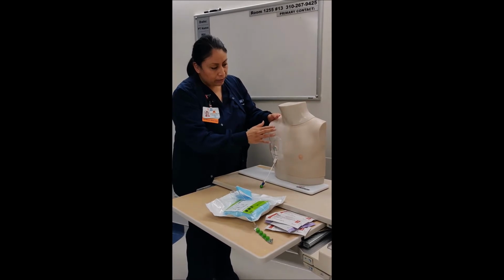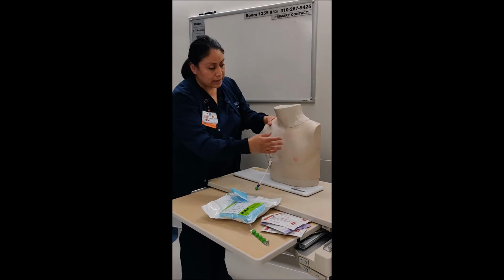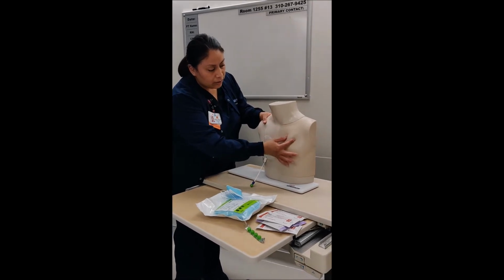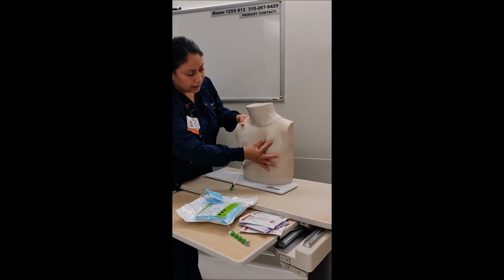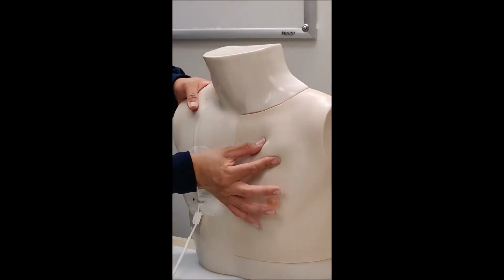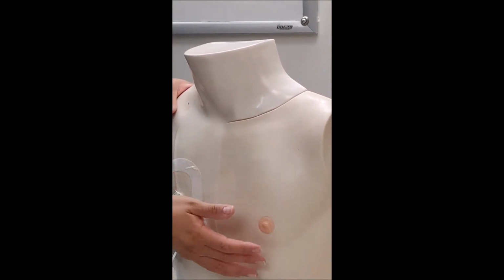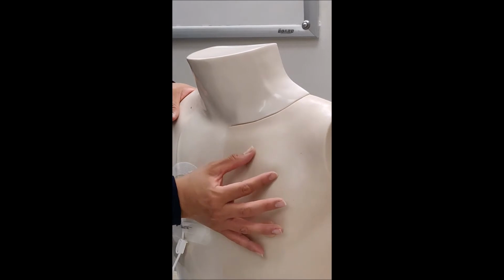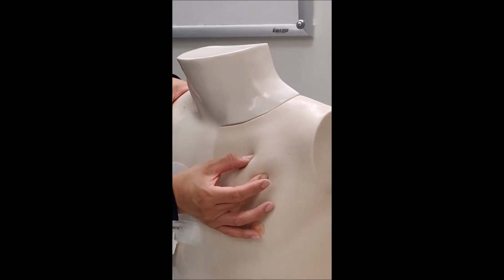So it's either on the right side or on the left side. Most of the time I've seen it more on the right side. But you are actually able to see the raised port through the skin, and you're able to palpate it. Okay, and just a quick tip: when you're going to access, you want to make sure you're using your thumb and then your middle finger to hold it as you're going to access.